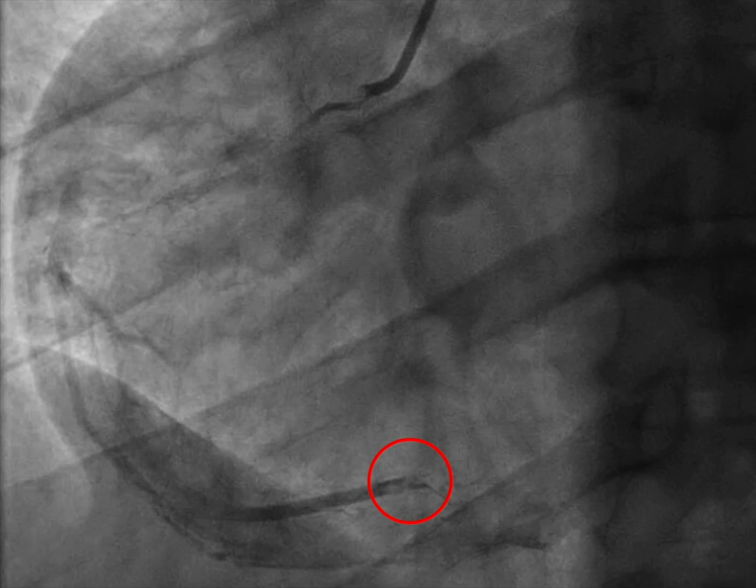You don't see a PDA, you don't see a posterolateral branch, so you have to conclude that this is actually in the distal RCA. And in fact, there's a little bit of regional variation in contrast, and that tells you that there's probably a thrombus here. So there's denser thrombus here, so there's less contrast there. There's a little bit less thrombus here, so it's a little bit darker, and so on.